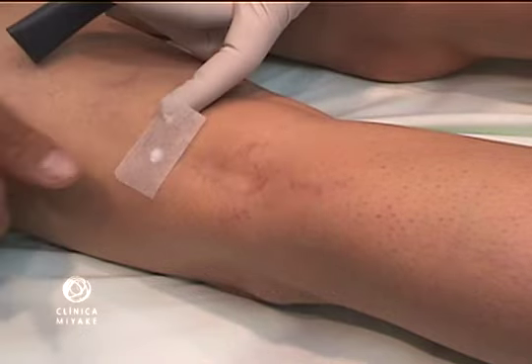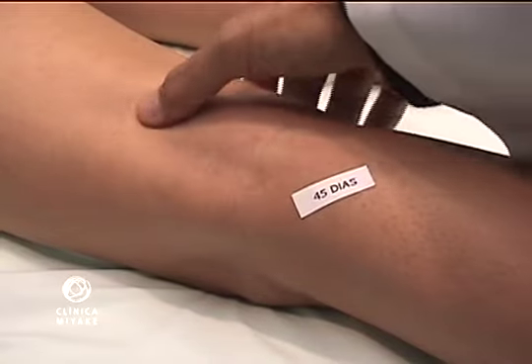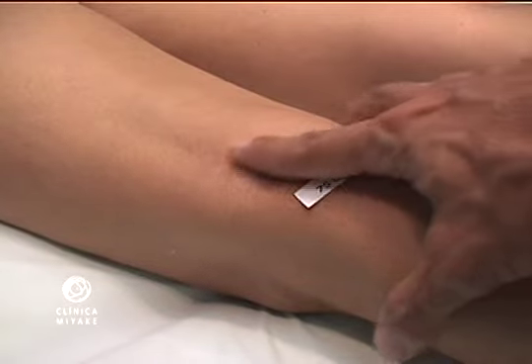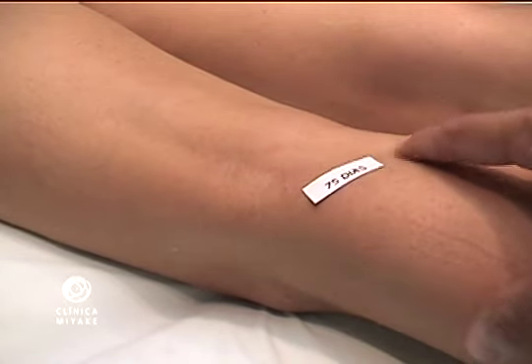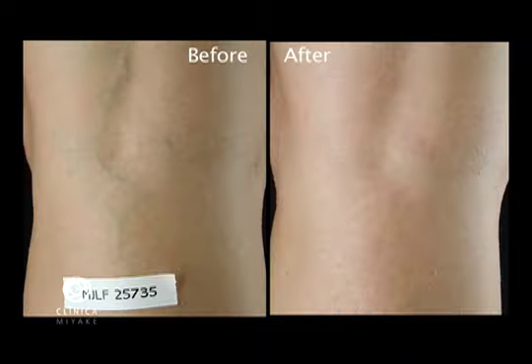Many of us agree that on leg veins, transdermal lasers were not the gold standard. But nowadays, 1064 long pulse lasers achieved selective photothermolysis, changing this scenario significantly. The laser action is very focal, and when employed adequately, it is a very effective method.